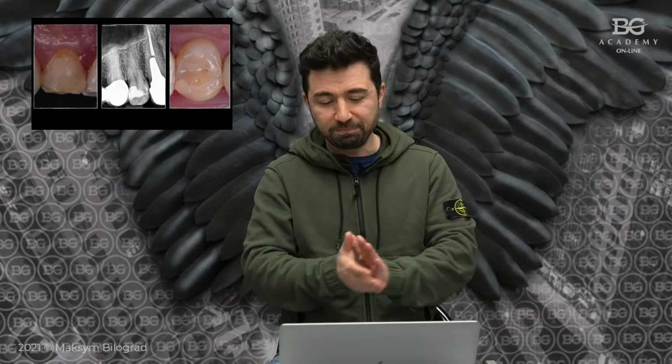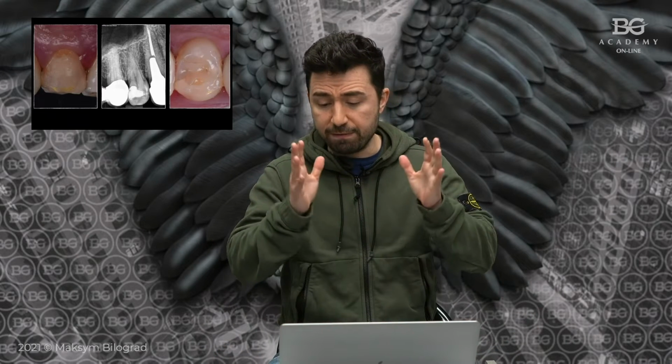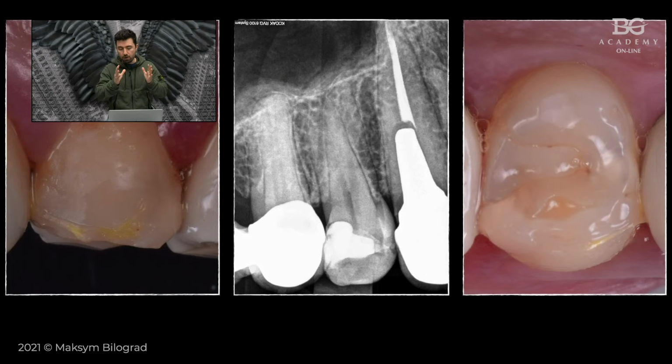Okay, so let's have a look. We have irreversible pulpitis for that particular tooth. This is upper premolar, and we have symptoms. We have pulpitis. We need to do root canal treatment, which is easy thing to take into consideration. Okay, but what I'm trying to say, before doing endo, we have to think about restorative part.